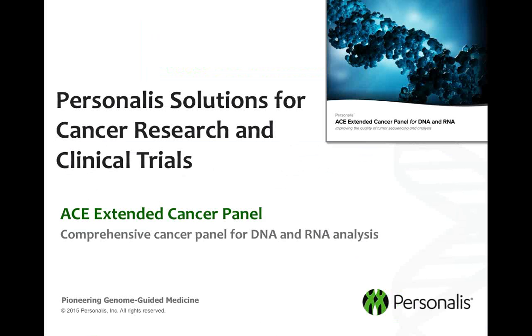So now for a more focused profiling of tumor samples, we developed an extended cancer panel of 1,600 genes to allow tumor profiling for clinical trials or even deeper interrogation of low allele frequency mutations in cancer, in addition to other applications in cancer research. And in the next few slides, I will describe the design of our cancer panel as well as some of its specifics.